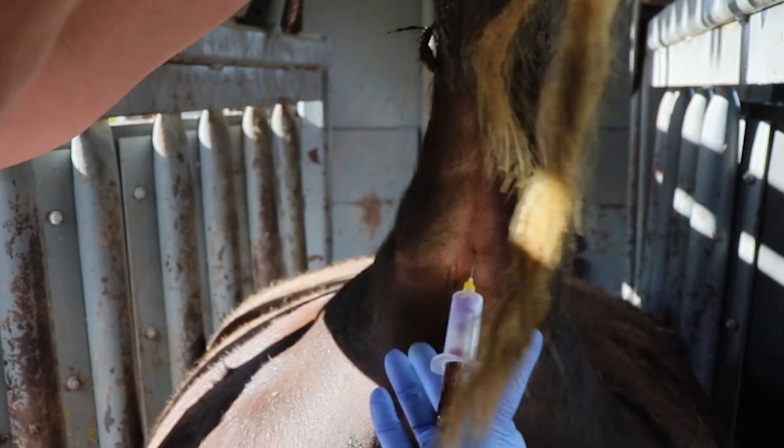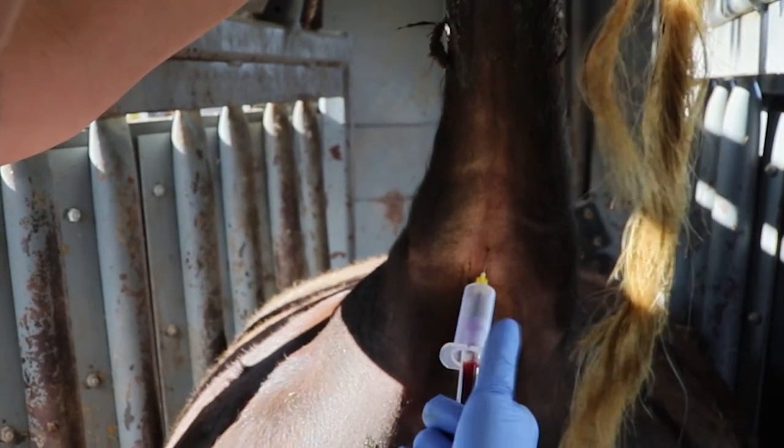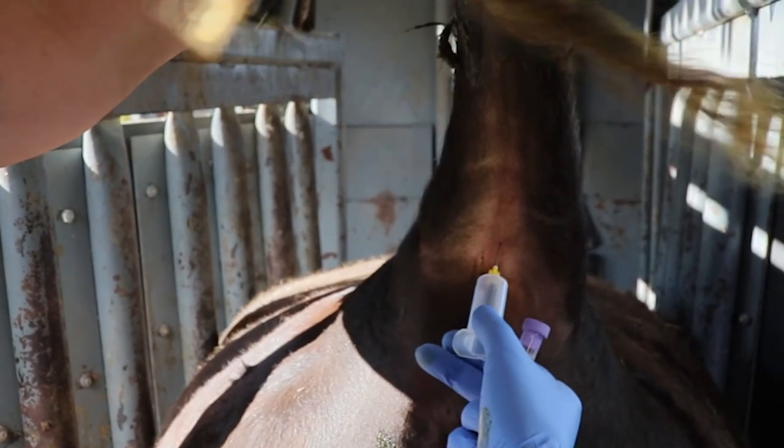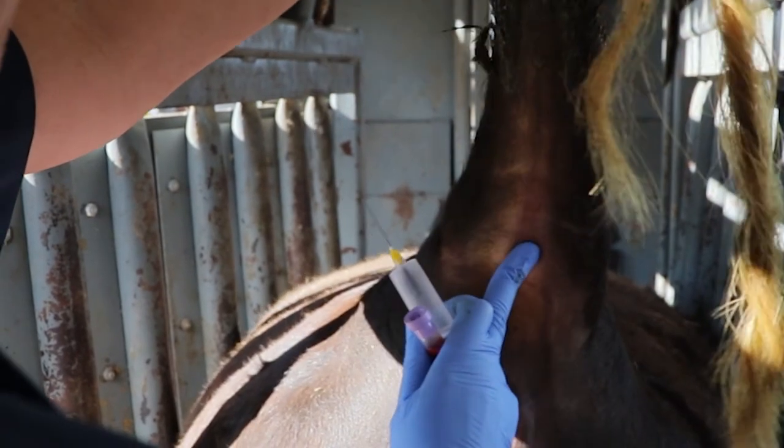If you take out the tube first before the needle, suction on the blood vessel stops and there's less chance of a hematoma. You may still apply some pressure and then you're done.